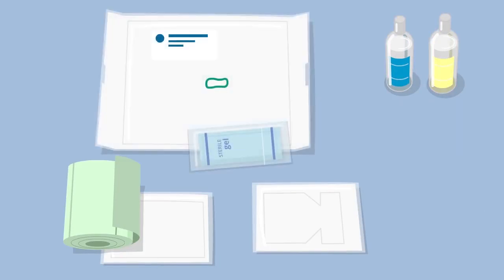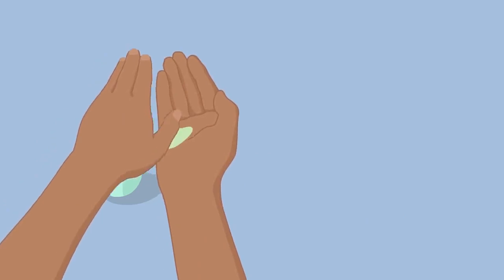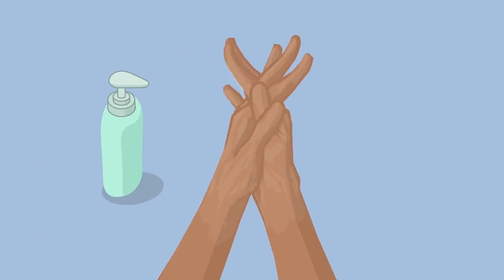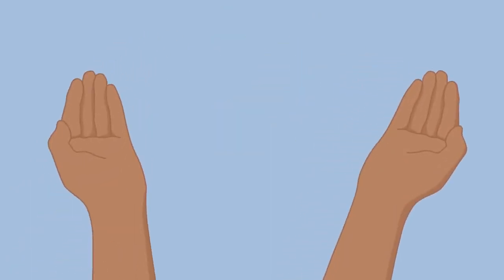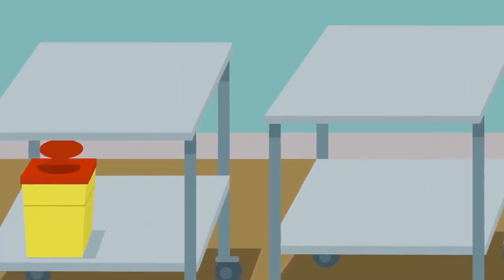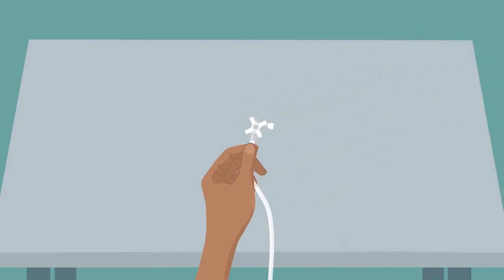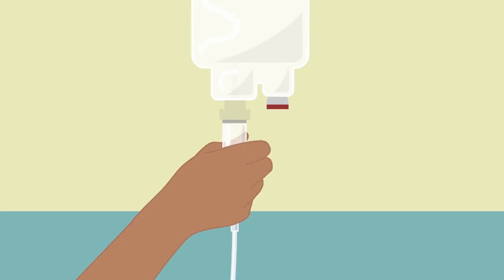Probe cover and sterile gel for ultrasound-guided insertion. Perform hand hygiene before preparing the perfusion. Prepare all materials on a clean and disinfected surface. Assemble stop cocks and tubes using an aseptic technique. Connect the infusion set to the perfusion and purge the system.